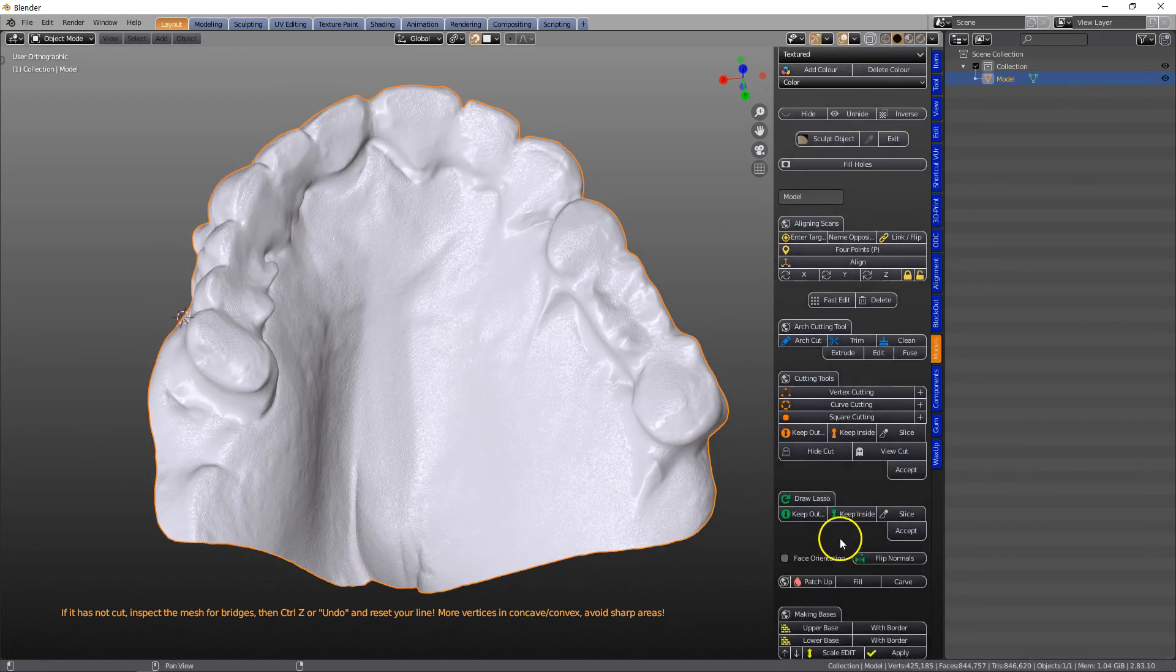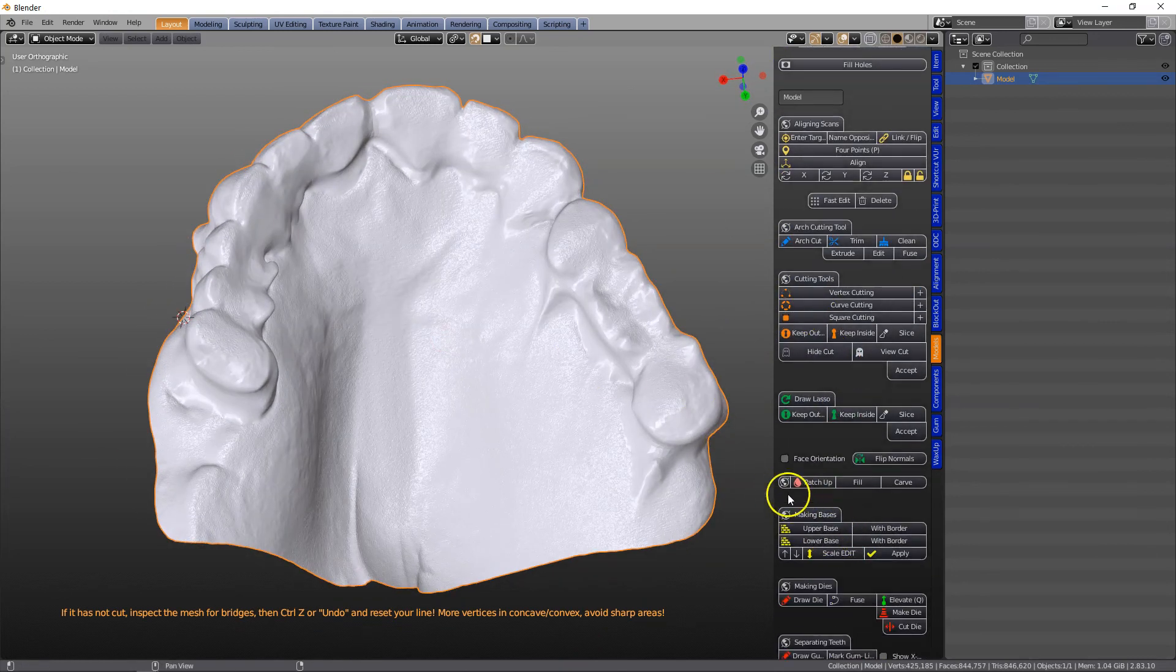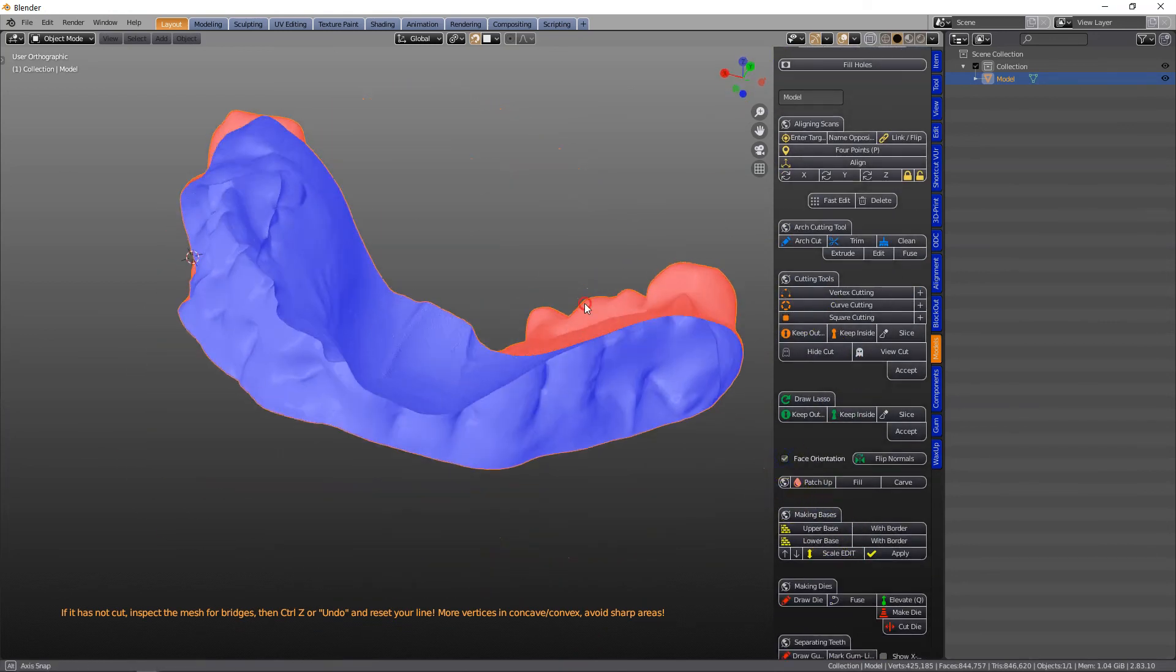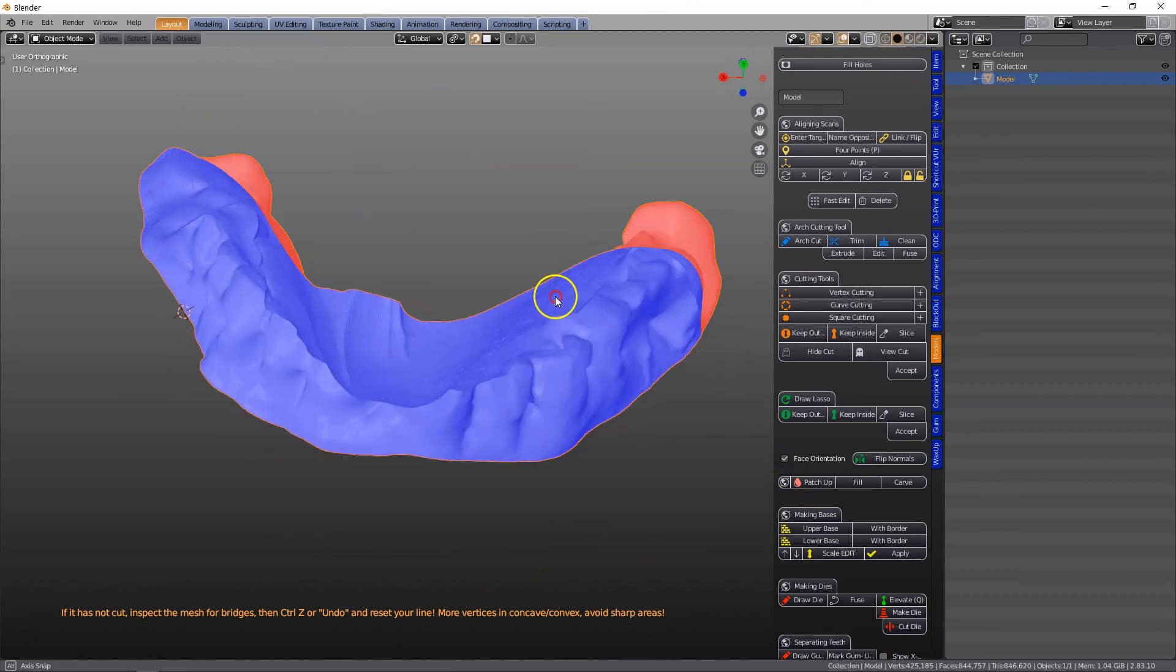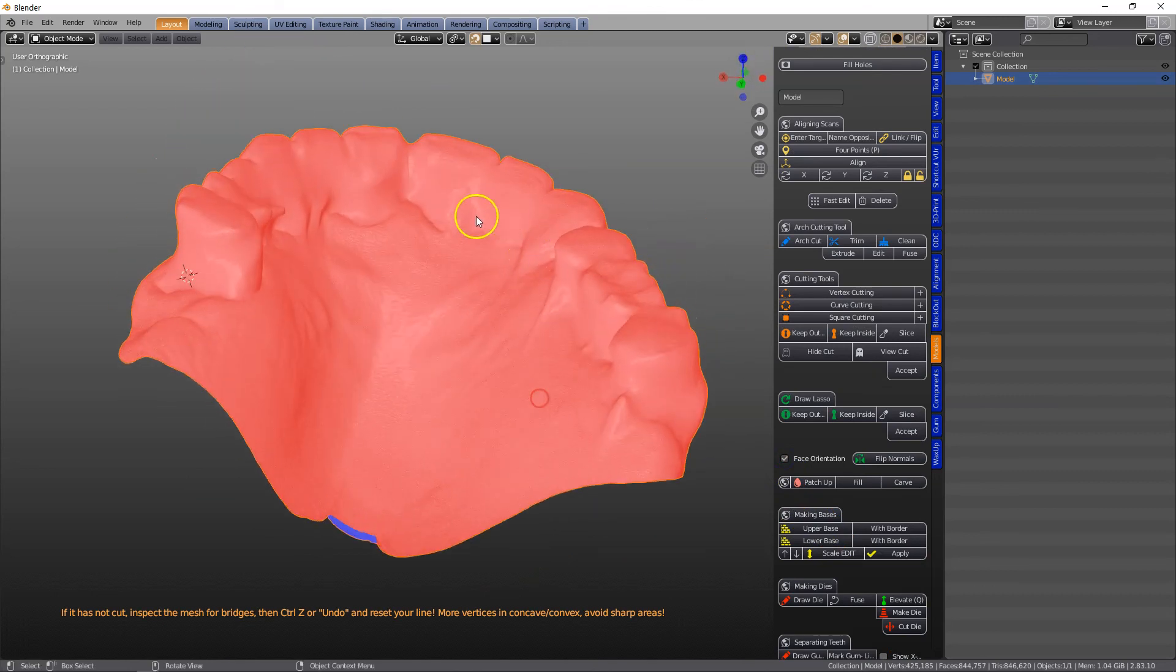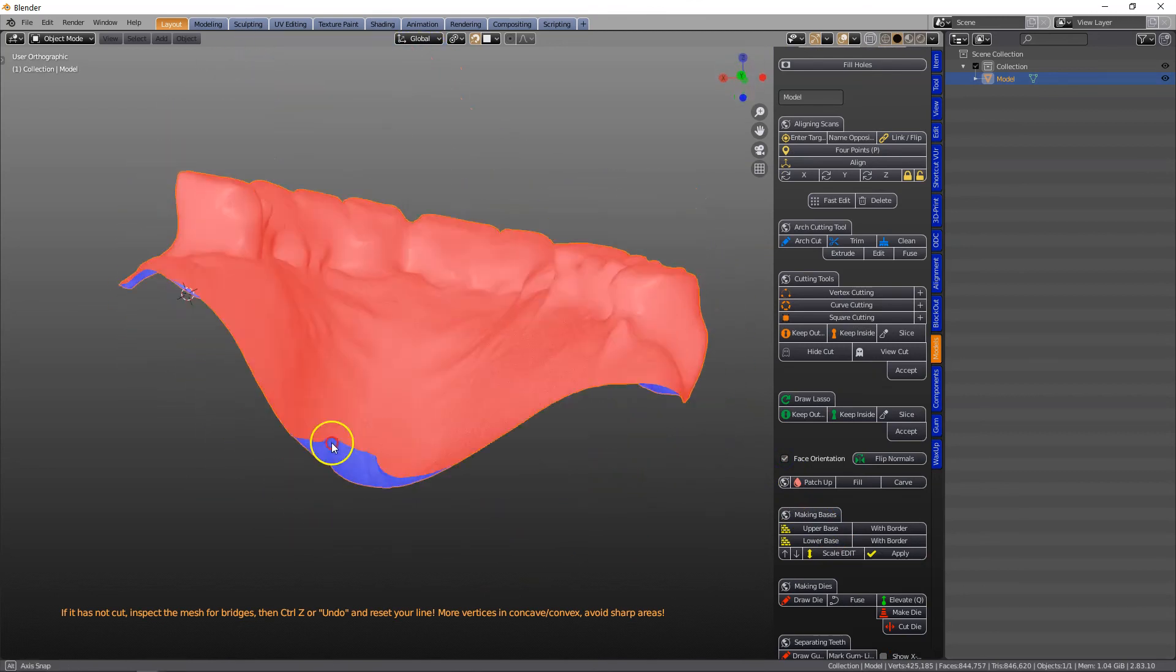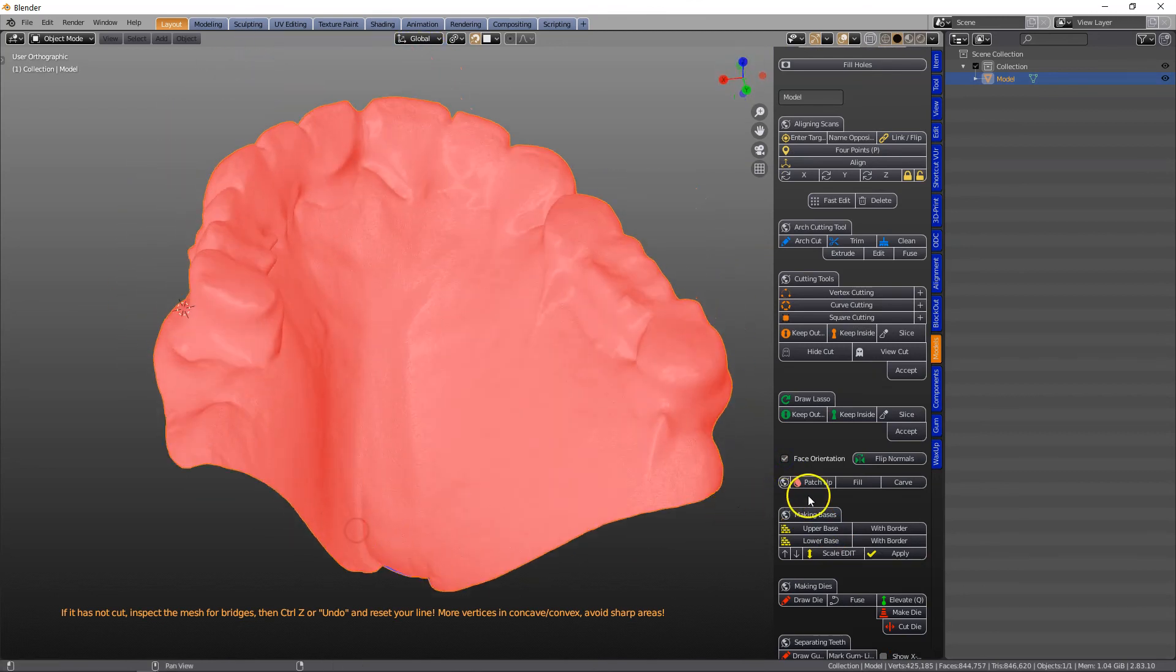Note that this is now inside out, so Face Orientation, because this was the inside, so we're going to flip the normals.